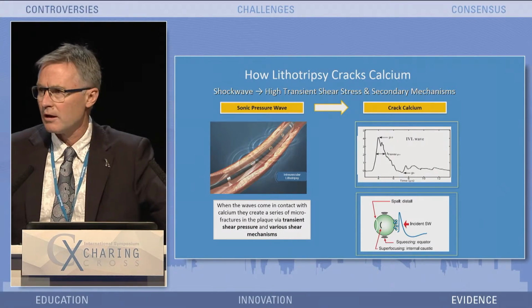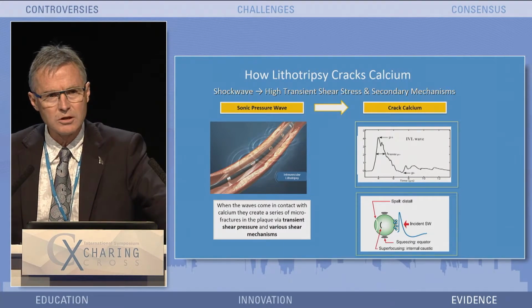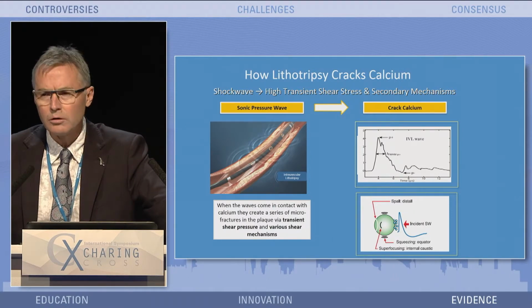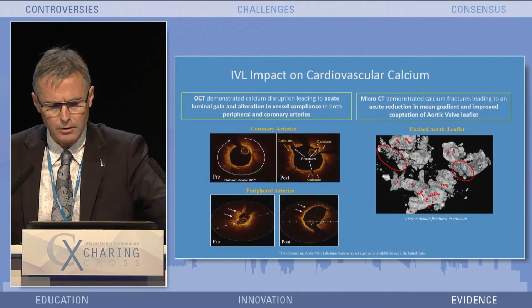Interestingly, it appears that the calcium, although microfragmented, is very stable in terms of any risk of embolization. Our experience initially was with the embolic protection filters, and we did not yield any embolic material, so we can microfragment the calcium in the various layers without a significant embolic risk.